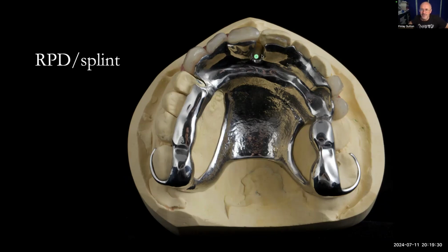But I've had to do a plate design which covers the gingival margin, which goes against the Scandinavian philosophy of hygiene on these front ones, because I wanted to give them a bite onto this metal surface here. Because if we just put the backings on the teeth with an open area at the front here, the lower front teeth would be unopposed and they would erupt into the palate again. So that's why it's a compromise, basically, but really good idea.